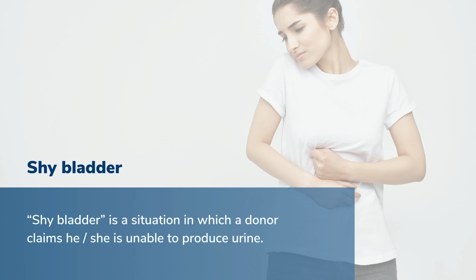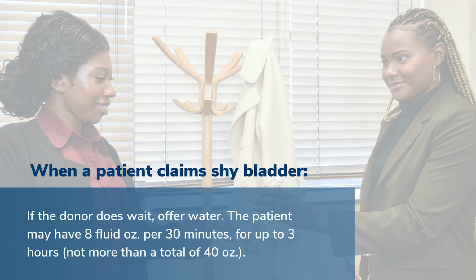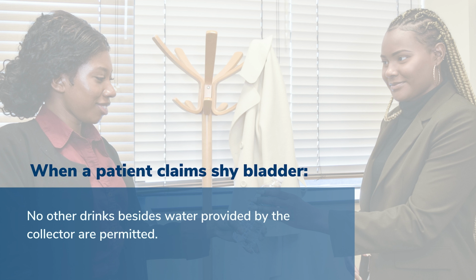Shy bladder. Shy bladder is a situation in which the donor claims he or she is unable to produce urine. When a patient claims shy bladder, ask the donor to wait until he or she is able to produce urine. If the donor will not wait, this is a refusal. Handle the situation accordingly. If the donor does wait, offer water. The patient may have 8 fluid ounces per 30 minutes for up to 3 hours. There should be no more than a total of 40 ounces of water given to the donor. No other drinks besides water provided by the collector are permitted.